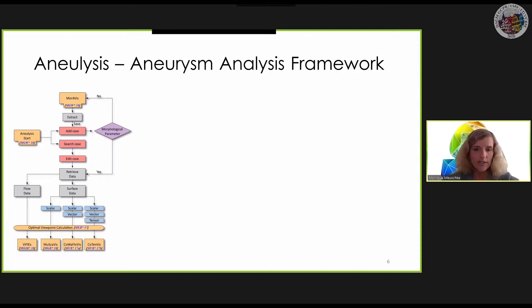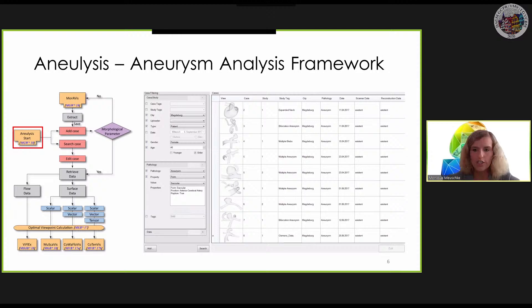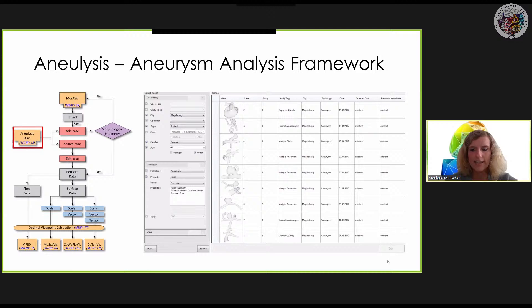All these methods were then integrated as modules into our software Anulysis. Anulysis allows a consistent administration of aneurysm data sets, which are stored in a database. The user is guided through the exploration of the complex simulation data in order to assess the risk of rupture and, if necessary, to find an optimal treatment. When the program is started, an overview of all existing data records in the database is given, as you can see in the image on the right. Starting from this view, the user has several options.